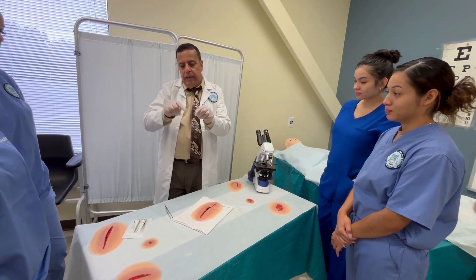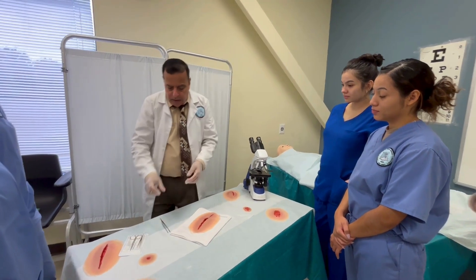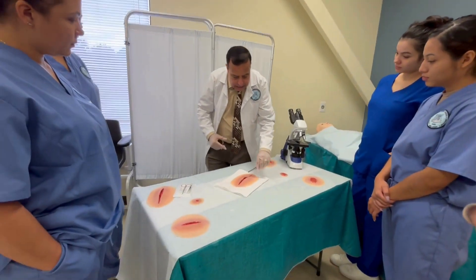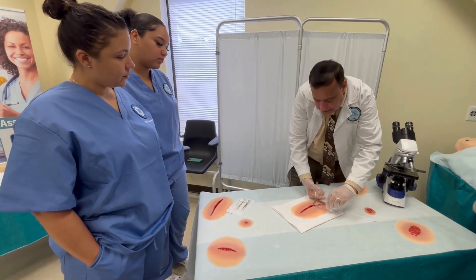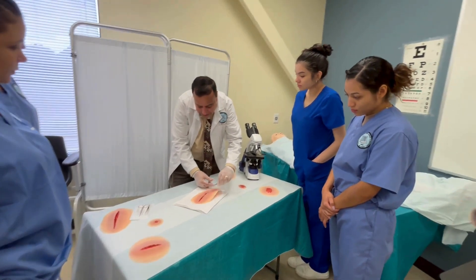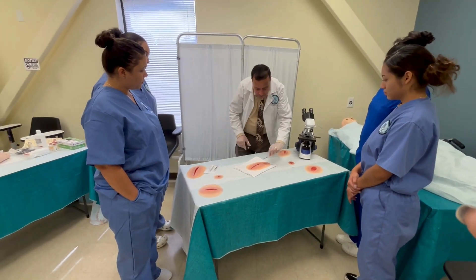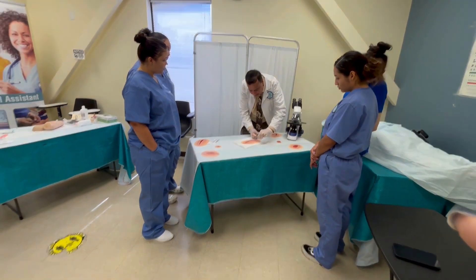To remove the stitches, I remove them one by one using the forceps and scissors. Hold the stitch with the forceps, slide the scissor tip underneath, cut the stitch, and then pull the first stitch out. You do this one by one — go to the next stitch, cut, and take it out.